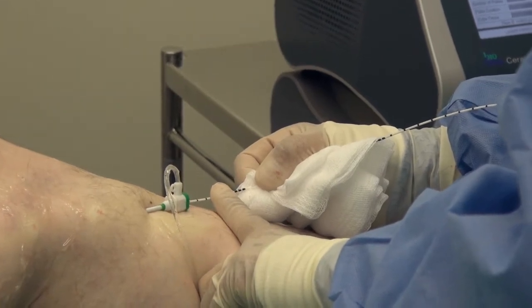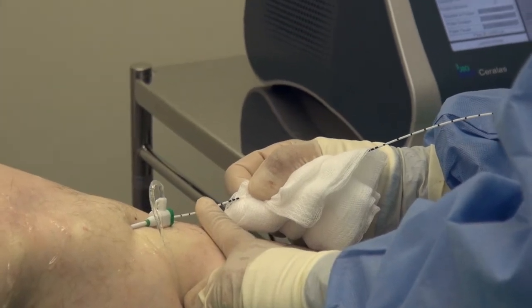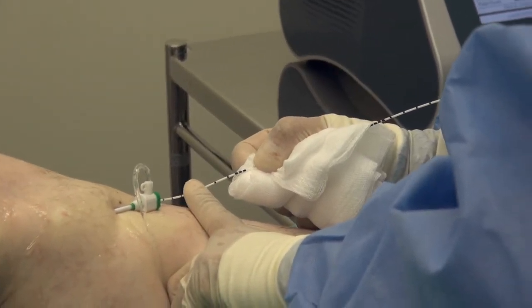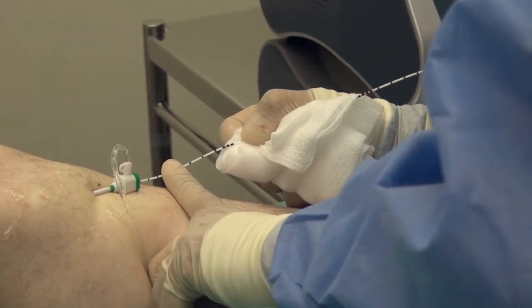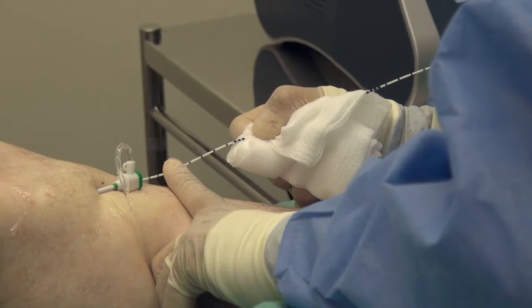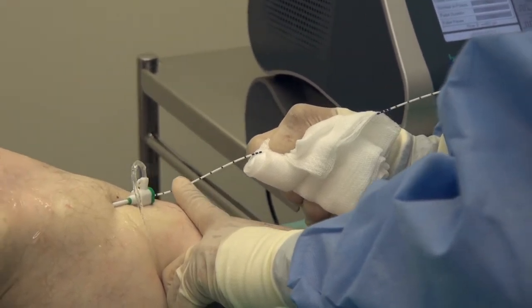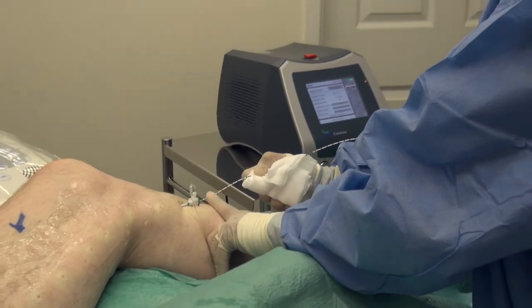My own personal experience of this procedure is that the discomfort is minimal, both during and after. It's a great procedure, and it's certainly a great alternative now to surgical stripping. Indeed, I haven't done any surgical stripping now for nearly a decade. This procedure is the treatment of choice.